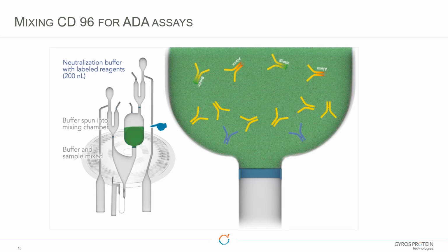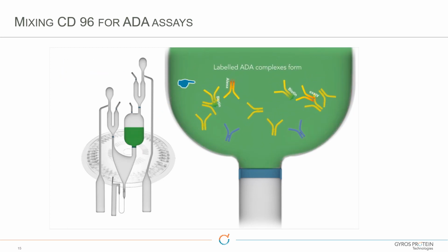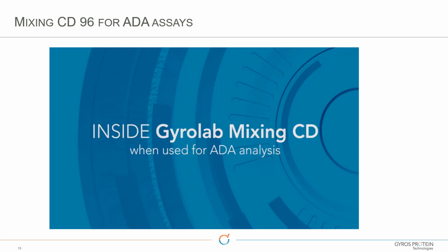And then the last step of the assay is to run the laser over the CD and scan those 96 well, or those microstructures, those affinity capture columns, and then we'll get our standard three-dimensional retained fluorescence image on the column that will then be the basis for the analysis.